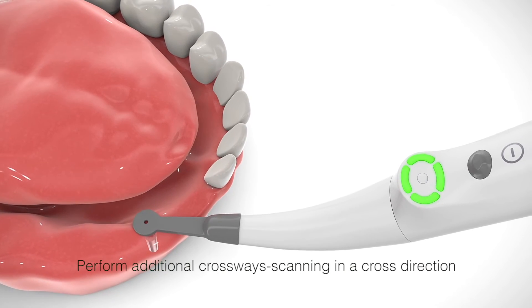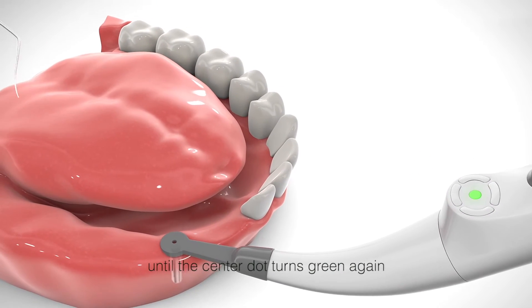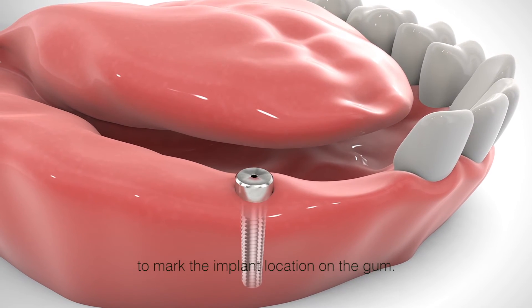Perform additional crossway scanning in a cross direction until the center dot turns green again. Insert a dental probe through the sensor center hole to mark the implant location on the gum.